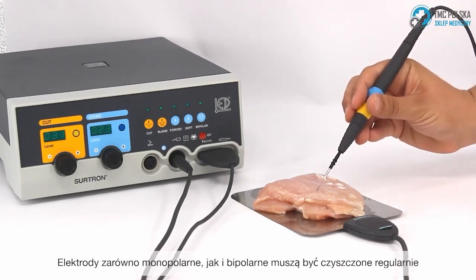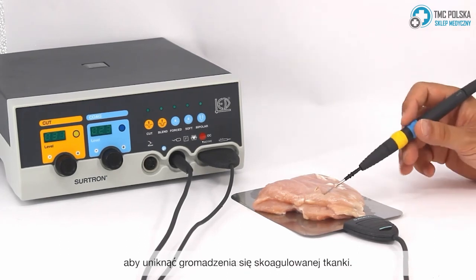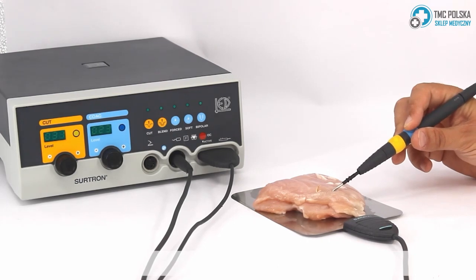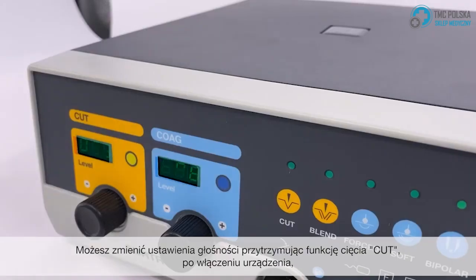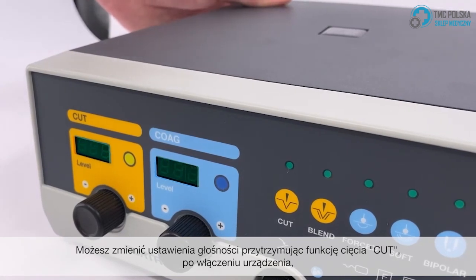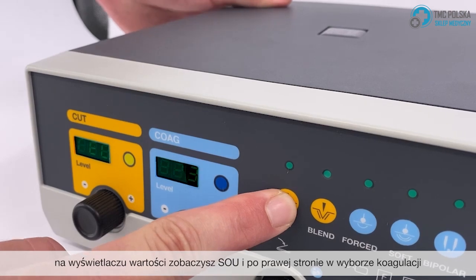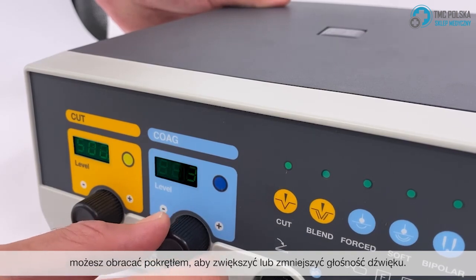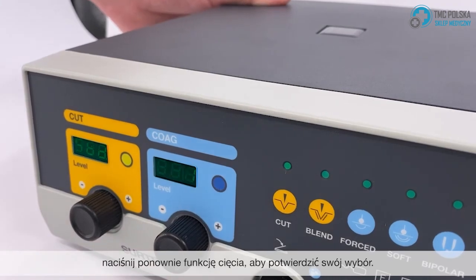Electrodes for both monopolar and coagulation bipolar must be cleaned continuously to avoid the accumulation of coagulated tissue. You can enter the volume settings by holding the cut function when you turn on your device. On the value display you will see SOU, and on the right side in the coagulation section, you can turn the knob to increase or decrease the sound volume. Press the cut function again to confirm your selection.